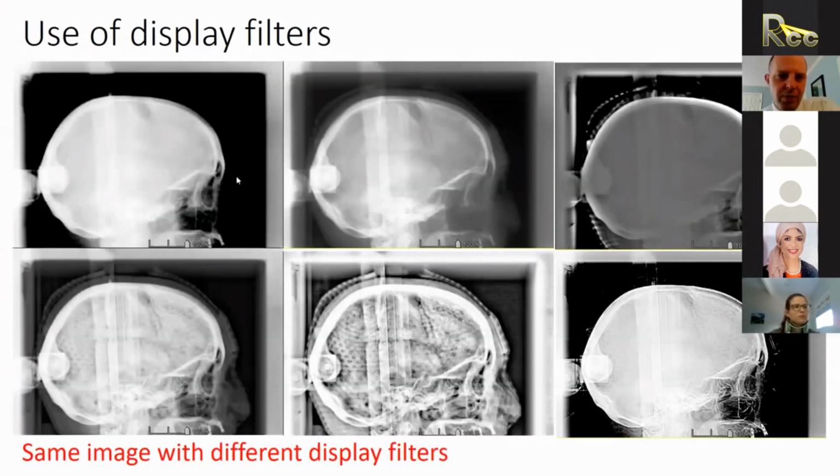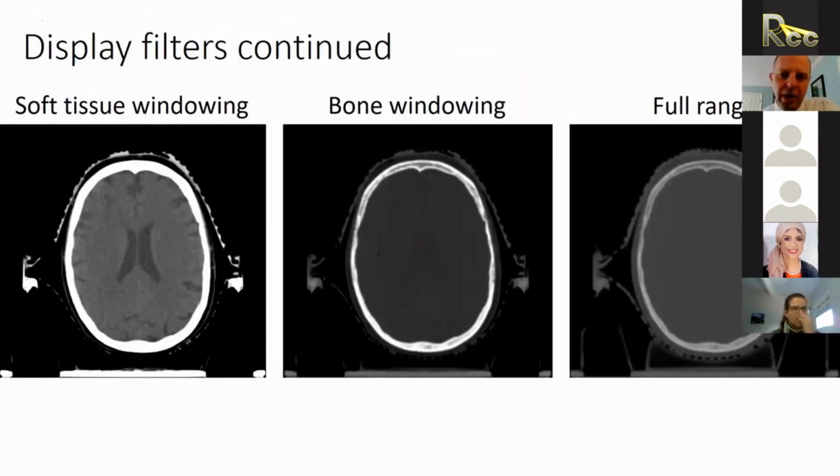I think for these ones here, some of these may actually have a non-linear relationship, but you can do lots of fancy things. I think it's just important to know that there are options out there, and to make sure that however you do it, it's appropriate for what you're trying to match.